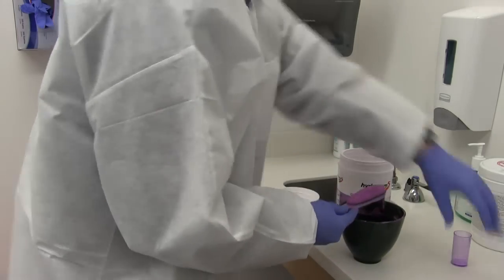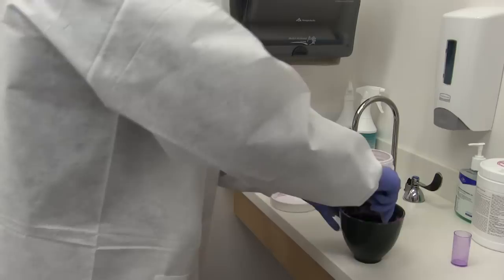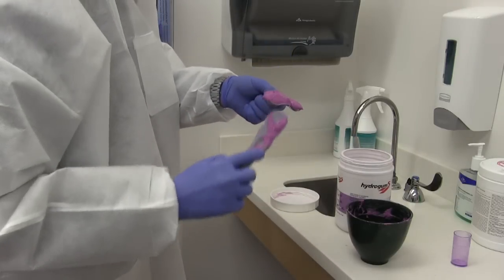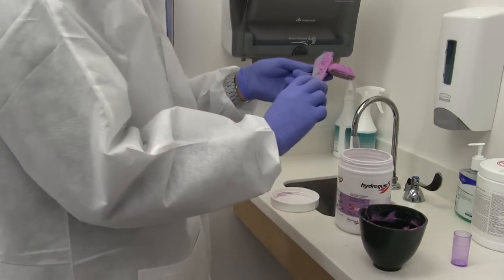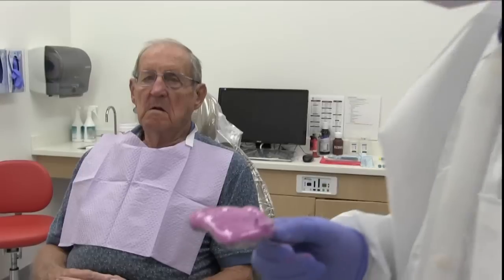So now here's what we're going to do. In small amounts, we're going to fill the tray with firm pressure to displace and ensure a good lock-in. We'll wipe the alginate into the palate in edentulous cases. In dentate cases, you'd wipe a little bit onto the occlusal surface of the teeth. I'm going to add a little bit extra to the peripheral area, then take it to the patient's mouth.